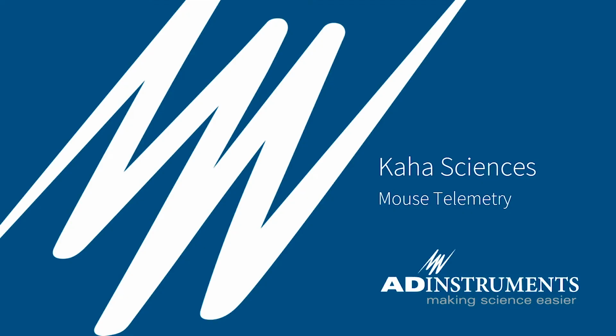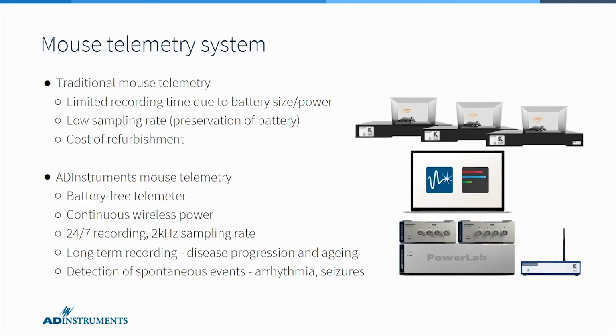So just to introduce the mouse telemetry system now. Traditional mouse telemetry is limited by the size of the implant and therefore the size of the battery that can be included in the implant as well. A small battery means that you're limited in the amount of power delivered to the telemeter electronics, meaning that recording time is restricted, and also the sampling rate has to be kept relatively low, as well as the cost of refurbishment and the time that takes up too.